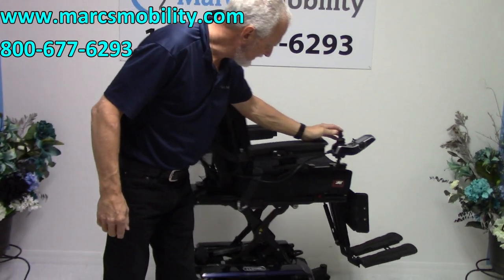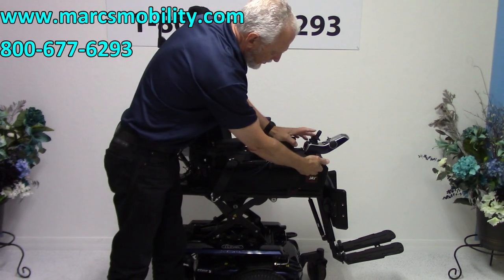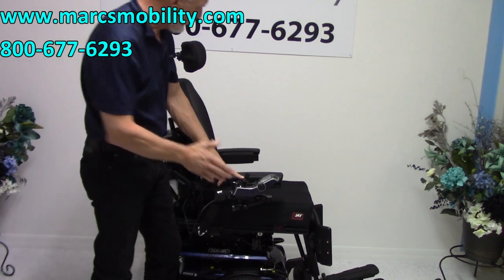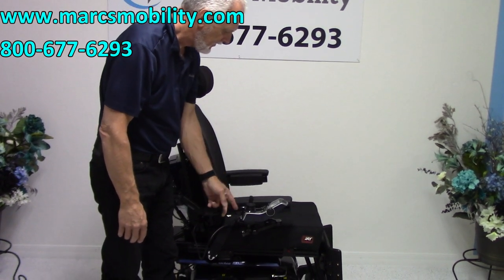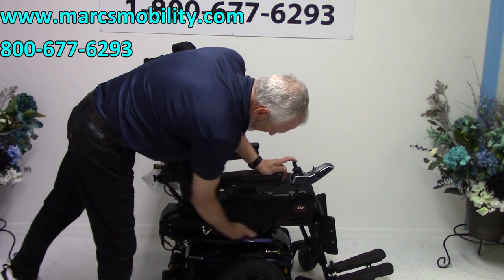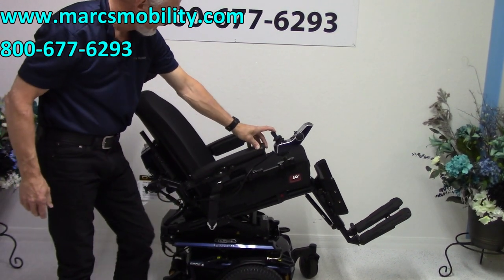I'm going to bring the seat back down. This chair has got a swing-away joystick, so you can swing the joystick away from the front to get closer to a table. Everything is set up on the right-hand side. If you're left-handed, we can switch this to the left side with no issues at all. Now, the next function I'm going to show you is called the electric tilt. The electric tilt is the base going back — when you have tilt, all of it is going to go with the tilt.